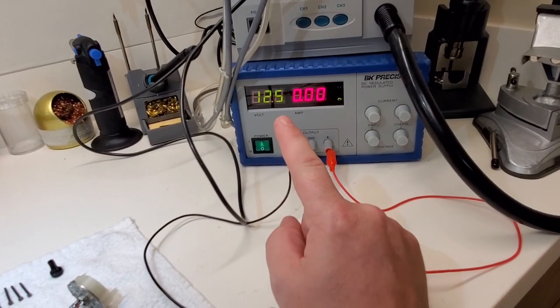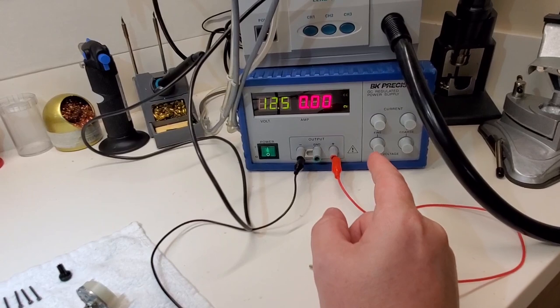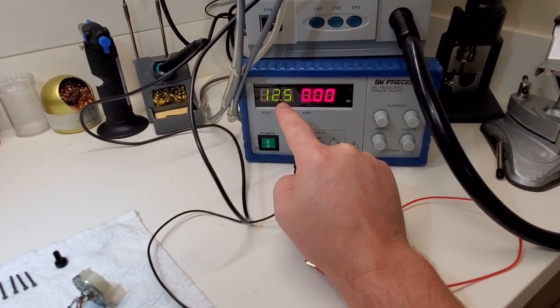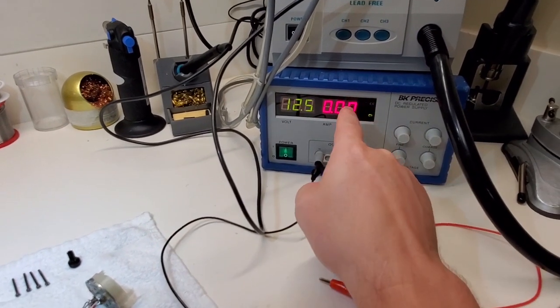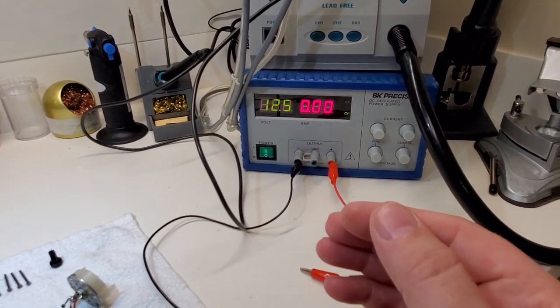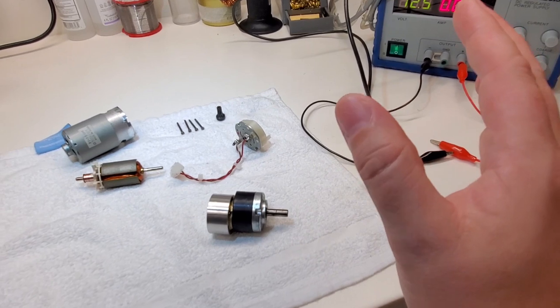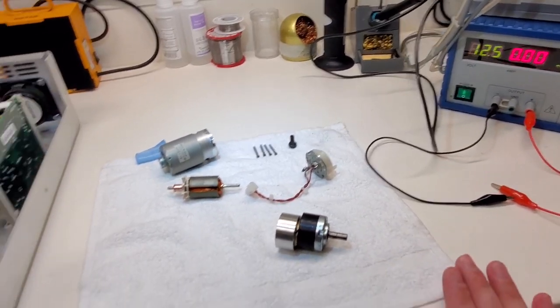I upped it to 16 volts and I increased the current dramatically to 2.5 amps. And when the motor would spin up, my voltage drop would be incredible. It would go down to 3, 4, 5 volts and I would be pulling 3.5 amps, I think 3 amps. This is only about a 3 amp power supply. So that's a lot of current, man. And there's no way this tiny little motor should be pulling that kind of amperage. So the motor's bad. Basically, the whole sum of the story, the motor is bad.